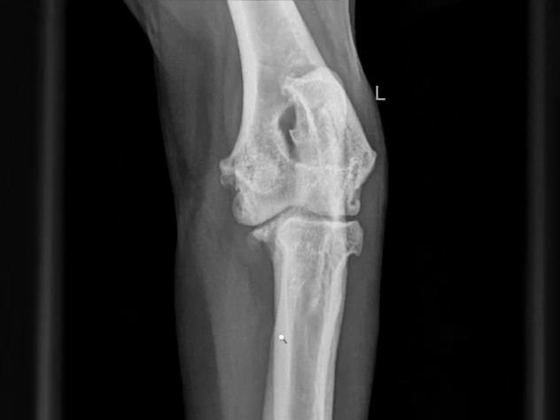Starting here on the left, I want to point out the location of the medial coronoid process, which is here. You'll note that it is sharply margined and it has some new bone formation on the edge. There is a small fissure noted here, which is radiolucent compared to the adjacent bone. Also noted on this view, you can see that there's new bone formation on the edges of the elbow, and in particular at this location, which is the medial epicondyle.